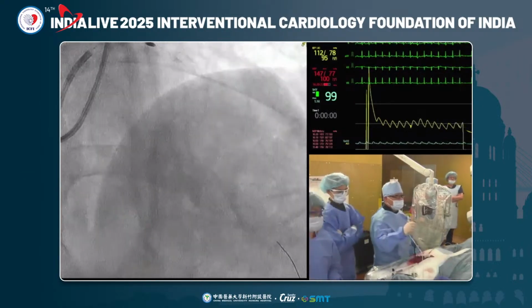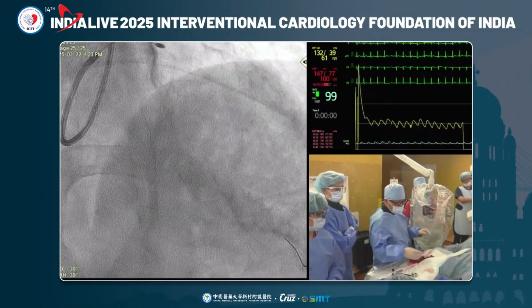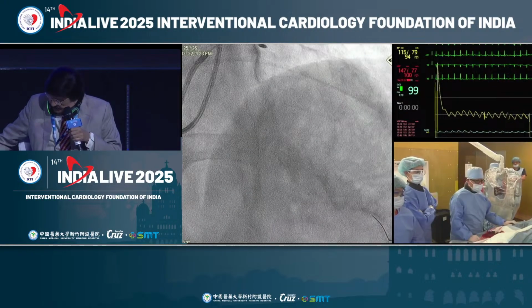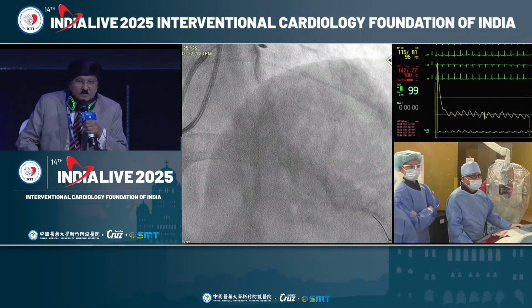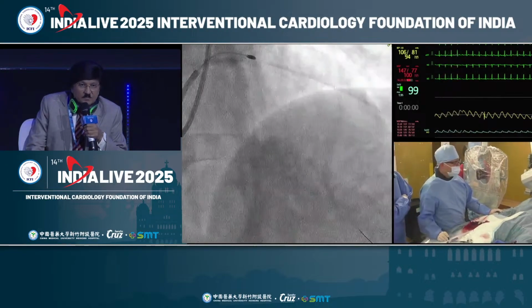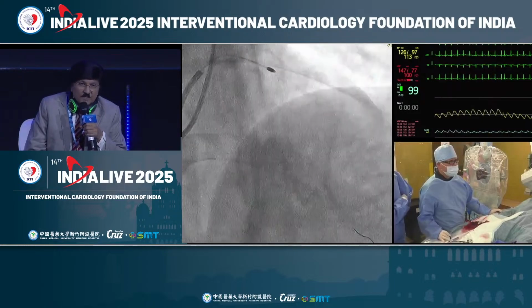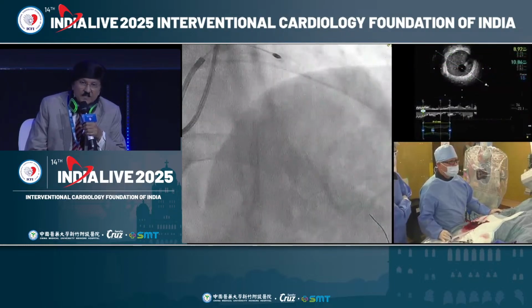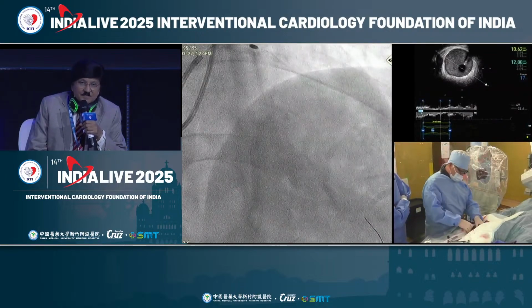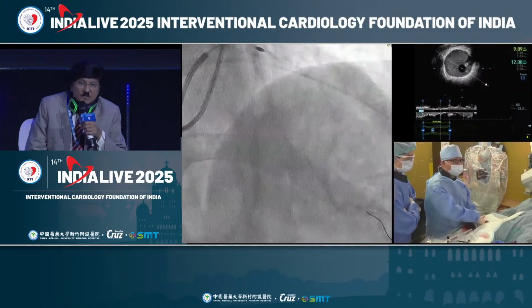So you are going ahead with an elective rotablation procedure before you do the imaging. Is that right? No, actually I have already performed the IVUS before rotablator. Let me share the IVUS. Can you see the IVUS? Yes, we can see the IVUS image before. Otherwise, we'll take your word for that. Okay, anyway, due to the time limit, I do both IVUS and rotablator simultaneously. And this is the IVUS finding.